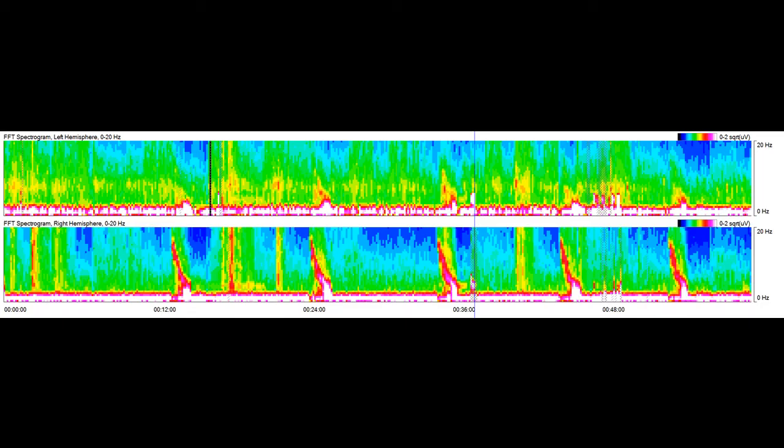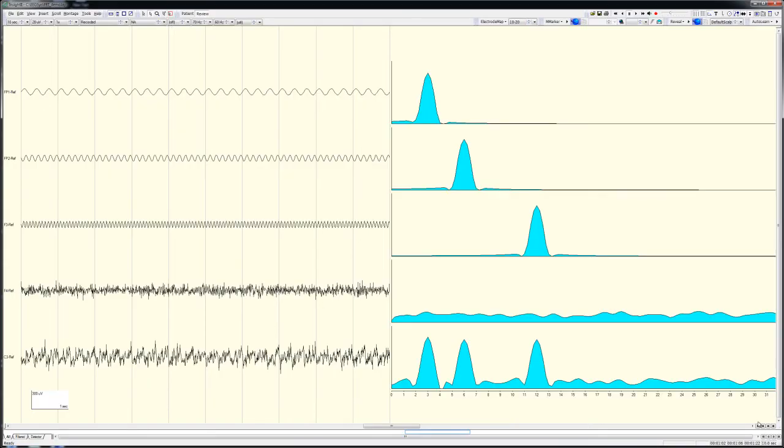To illustrate how this is done, I created a simplified set of signals and then ran an FFT analysis on them. Here the first three traces on the left are 100 microvolt peak-to-peak sine waves. The first is a 3 Hz sine wave, the second 6 Hz, and the third 12 Hz.